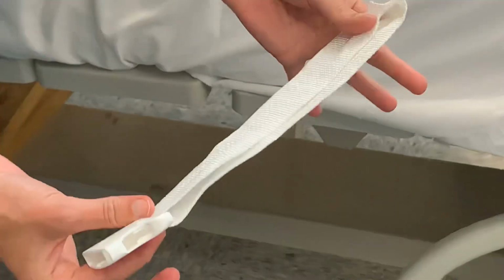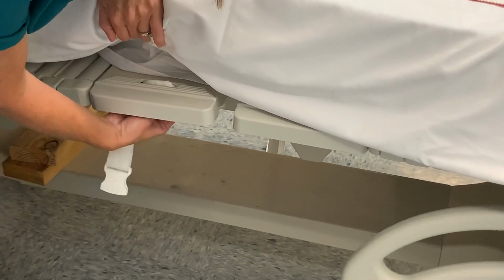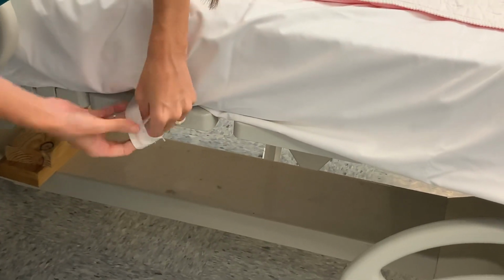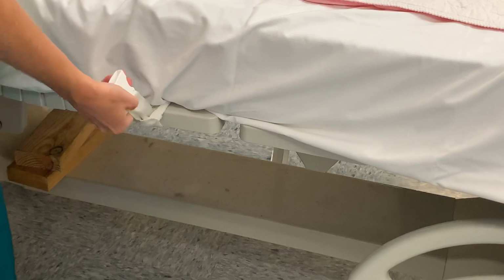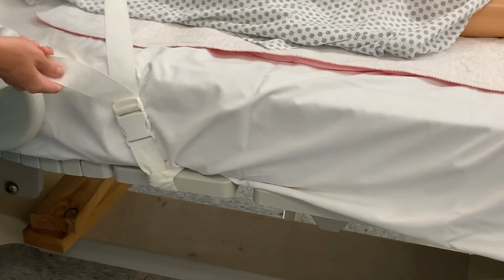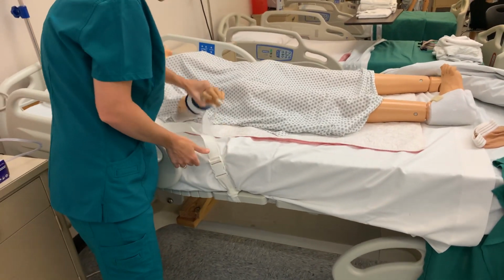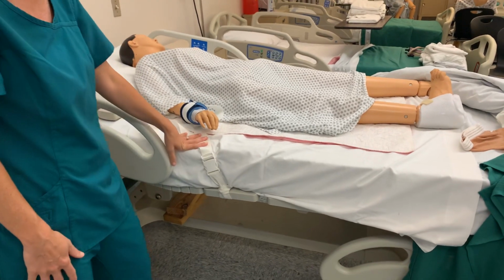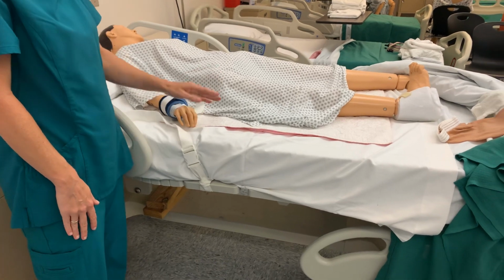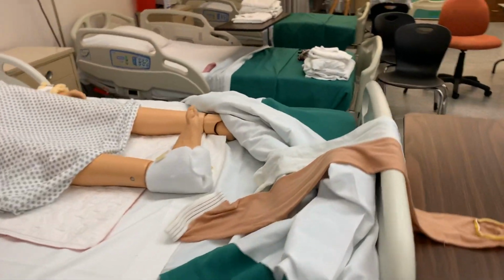This part with the buckle here, I actually took and found an area of the bed frame, non-movable part, and then I just loop this through like that, and then secure like that. And then as far as distance that you're wanting them to be able or not be able to lift their hand, you can tighten this up to restrict movement as needed there. Always, always, always check circulation.